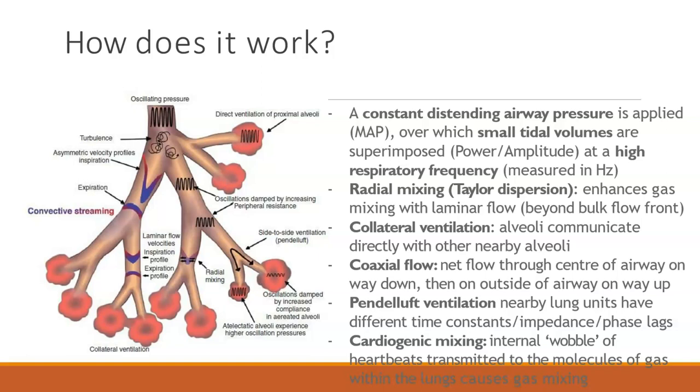It's because the air is going straight down into the airways, all the way to the alveoli. And then at that same point, it's coming back out around the edges of the airways.